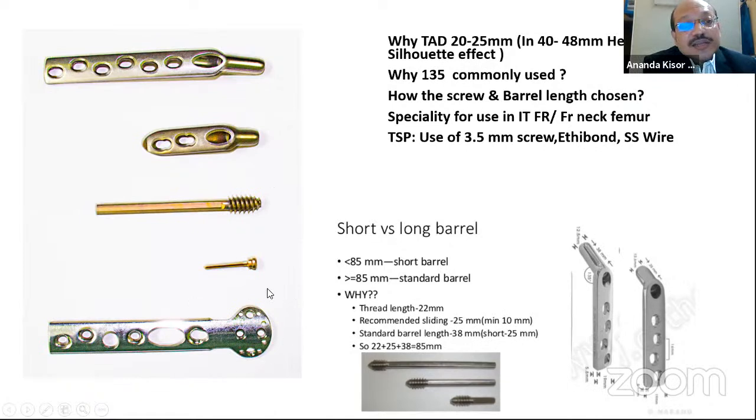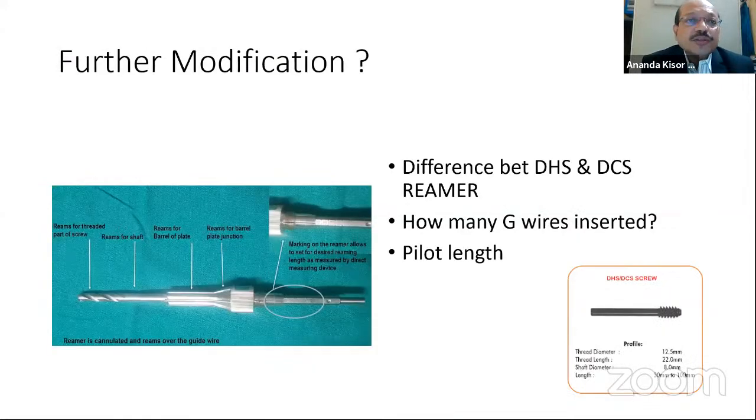And this is the trochanteric stabilization plate. A 3.5 millimeter screw should be used on this. And what is the utility of this locking? Ideally, you tighten it and remove it. Otherwise, after tightening it doesn't have any function, so remove it. Further modification will come there.